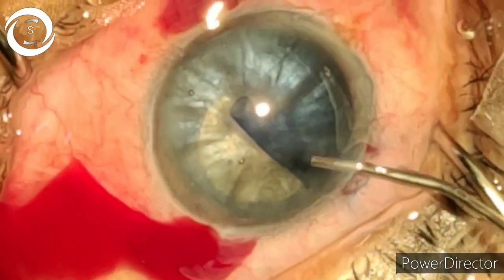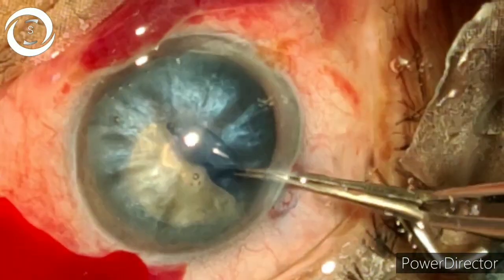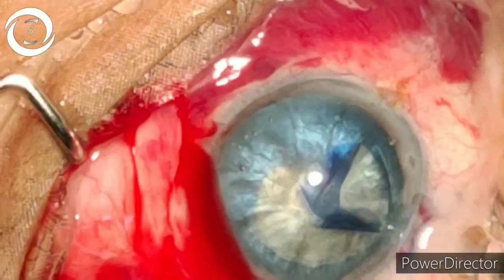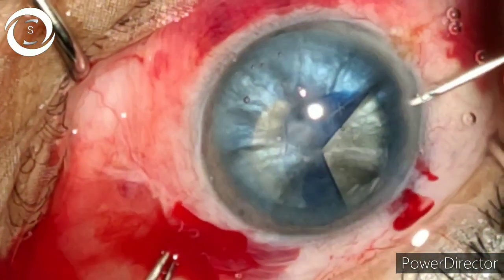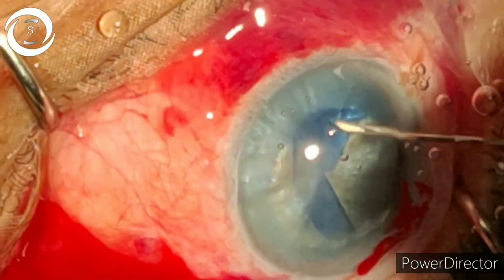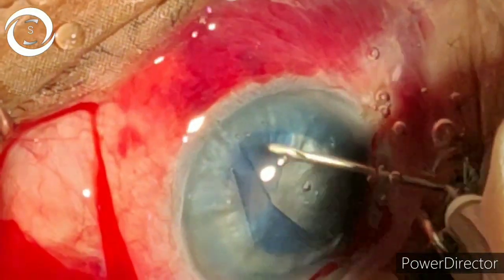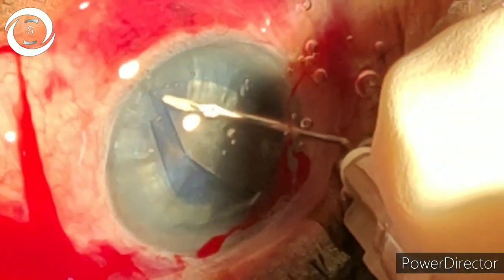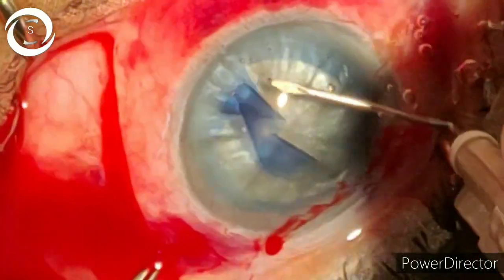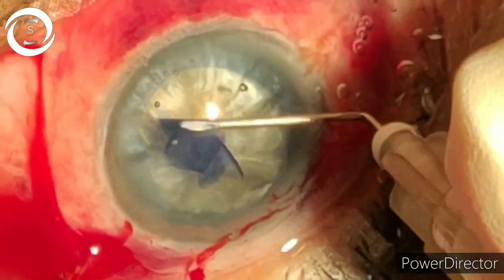About half of the capsulorrhexis was performed with the cystitome, but as it was becoming radial I took the help of Utrata capsular forceps. With the Utrata I managed to bring the anterior capsule back into range, and then with the cystitome I completed the capsulorrhexis. Take your time — this is the most important step, don't rush. A large, round, regular continuous curvilinear capsulorrhexis means no matter how hard the case is, you will be able to complete it with ease.